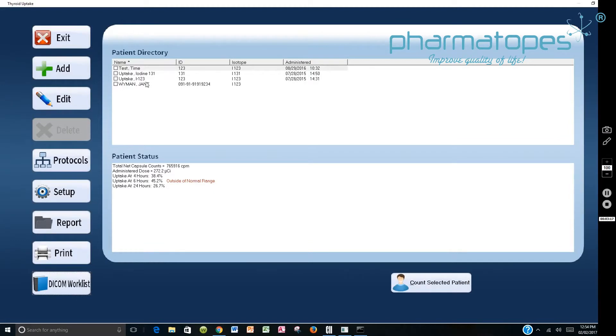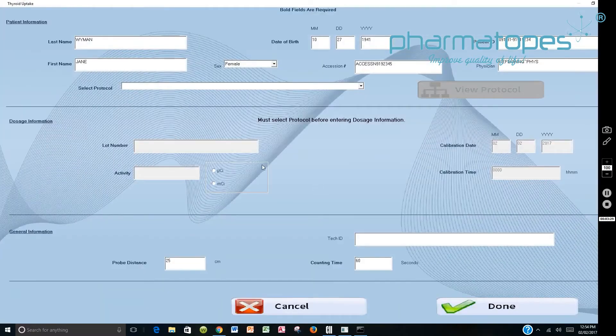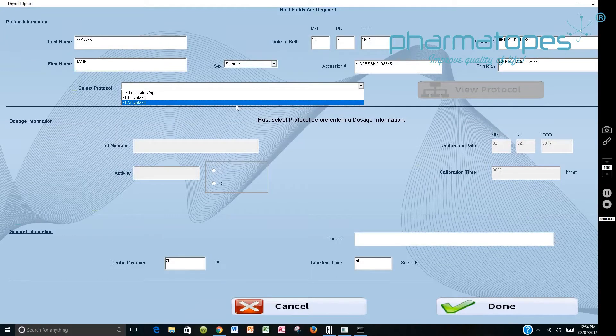Now that we've got it there, we want to select Jane Wyman. Once we've selected the patient, it's going to come back and say there's additional information needed for this patient that you've just pulled over. So you say yes. We want to update it. So you have to select the protocol. In this case we'll say I-123 Uptake.